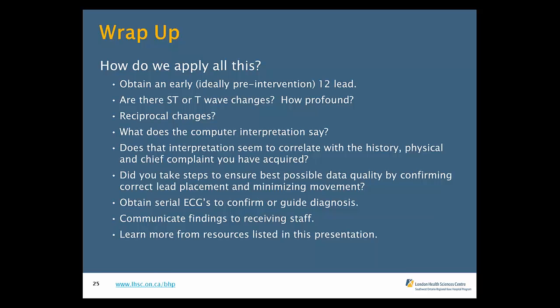We try to pass on that importance to our nursing staff about how important the pre-hospital ECG is. And often these changes that occur in the pre-hospital setting, we're not capturing in the emergency department. So again, another important tool for that pre-hospital ECG, and a way that your care in that pre-hospital setting is actually making a difference. And things could be missed in the emergency department if we don't have these pre-hospital ECGs, so a super valuable tool. And again, we've gone over all of these resources, and I encourage you to keep practicing, keep looking at ECGs, and this is the only way that you're going to get better at this. Matt, back to your point about communicating, making sure that's available for the physician.